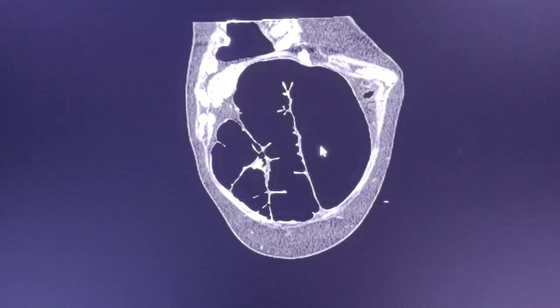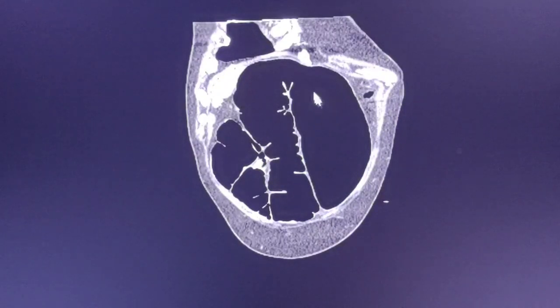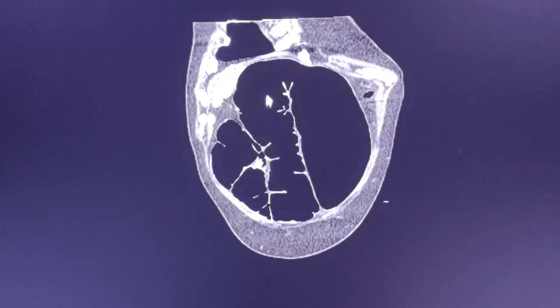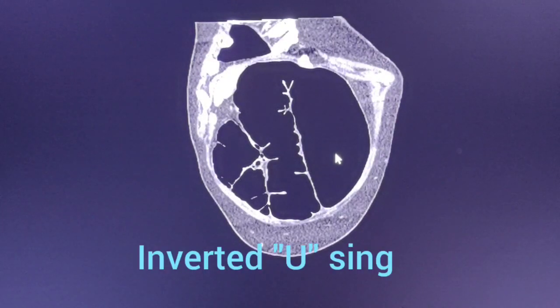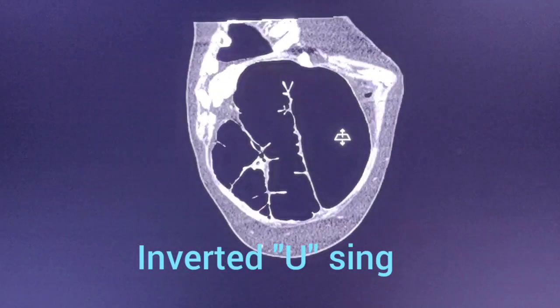In coronal views, you can see the typical reversed U shape of the sigmoid colon. This is the typical sign of sigmoid volvulus.